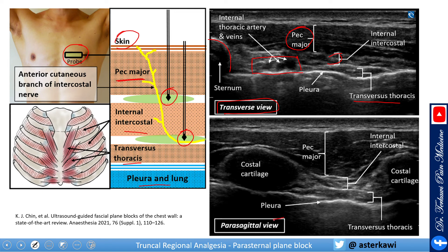In the parasagittal view, we are looking at costal cartilage, which is the end of the rib. The angle is steeper here. You can approach either superficially or deeply, but the superficial approach is quite straightforward in the parasagittal view. For the deep approach, I would recommend using the transverse view.